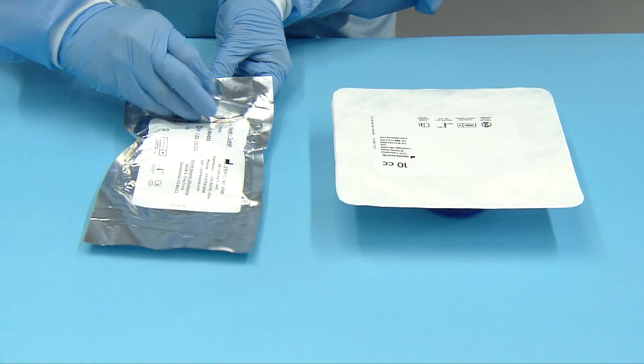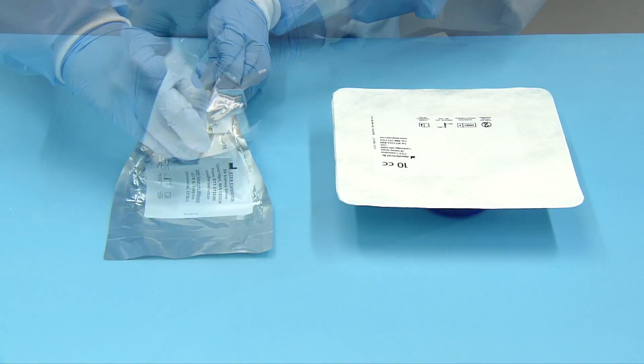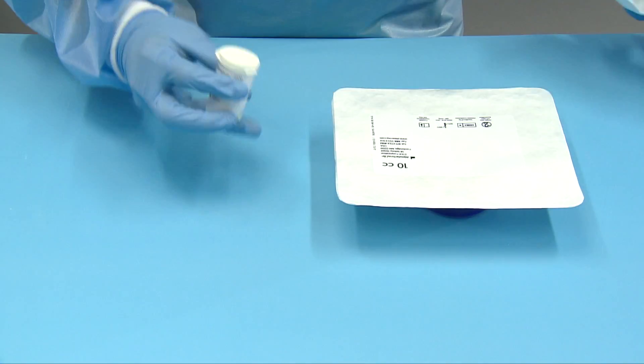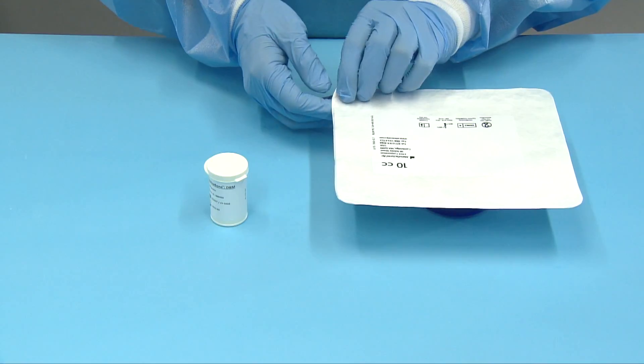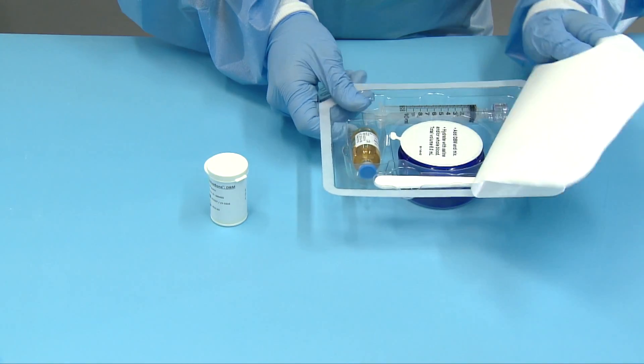Remove both the calcium phosphate pouch and the DBM pouch. Remove and peel the DBM into a sterile field. Open the carrier pouch and dispense all contents onto sterile field.